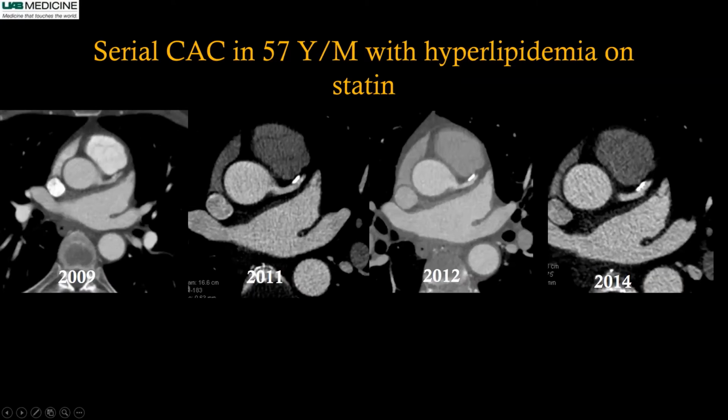So I think down the road, this may be an important modality to objectively evaluate the effect of therapy on the coronary atherosclerotic plaque, especially if the scan is easily done, it is of shorter duration, and the radiation dose, which is the biggest factor, is much lower. If we can do a prospective scan with 1 millisievert or 2 millisievert, I think this will be a fabulous way of screening coronary CTA for atherosclerotic disease and looking at the effect of therapy.